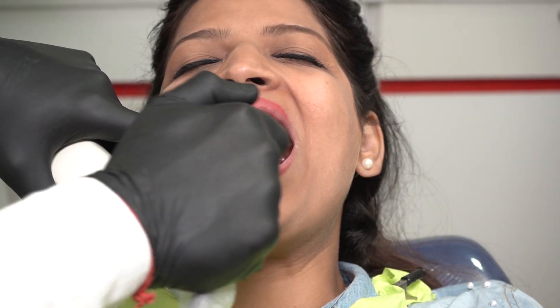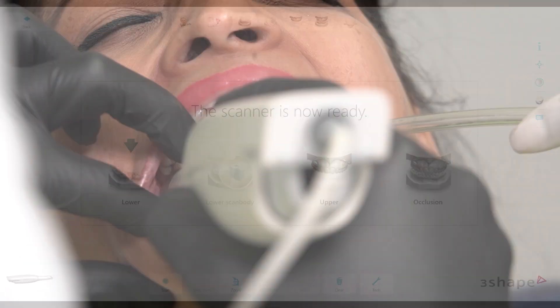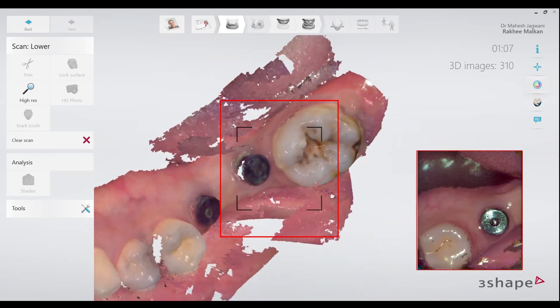For implant scans, there are two major steps involved apart from the usual workflow. There's the scan of the emergence profiles, which is to be followed by stitching of the scan bodies. The easiest way to do this is by scanning the arch with the healing abutments in place first, by following the usual scan strategy.